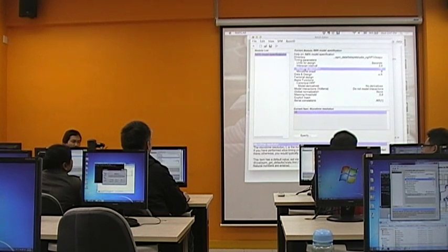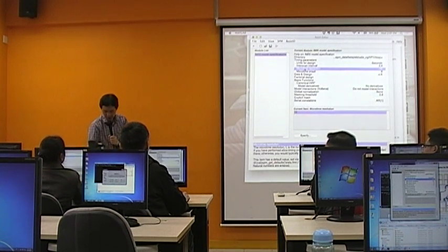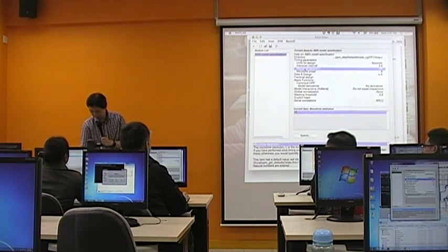Remember that? We have a particular shape of the BOLD response, and then you have a chain of events, and then you build an expected time course.